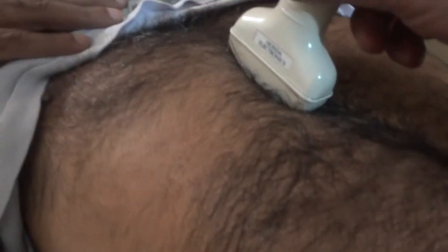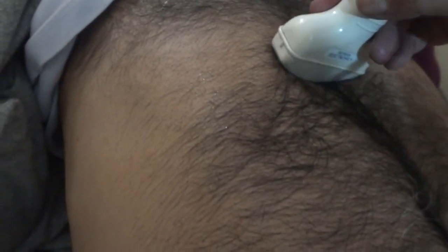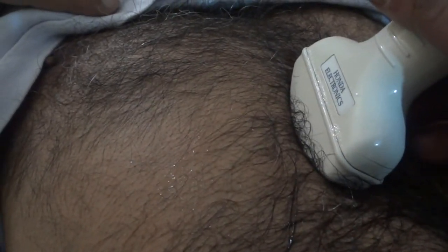The scanning plans for the liver are longitudinal in the epigastric region, then subcostal sweep, again longitudinal, then angling in this direction.